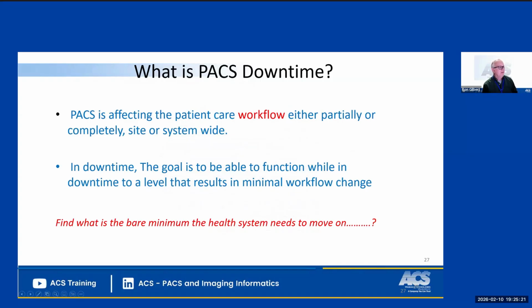So patient care workflow is what we're interested in, how you get information from one place to another. And downtime, the goal is to be able to function while in downtime to a level that results in minimal workflow change. You don't want to have to run around and tell the technologist, okay, here's what you're going to do now. You won't have time. You want to basically have a workflow that you can say, hey, we're going to secondary. And they look in their book and they say, okay, got it. And now they're able to do it.